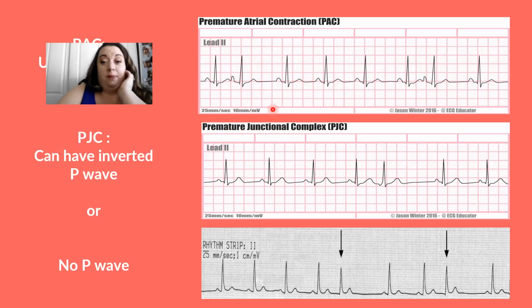So if you think your patient is having PACs, you might sit there and watch the rhythm for a minute as it's moving, and you'll see it, because when they have premature beats, usually the underlying rhythm is pretty regular. If I just cut out these 4 beats out of my rhythm, this looks like a normal rhythm.